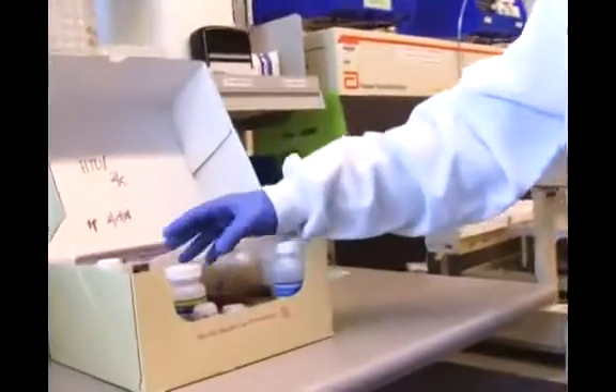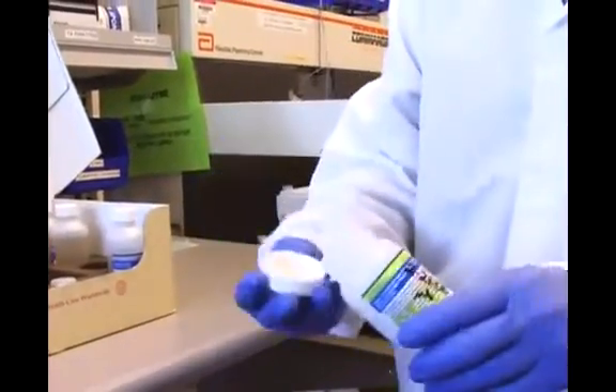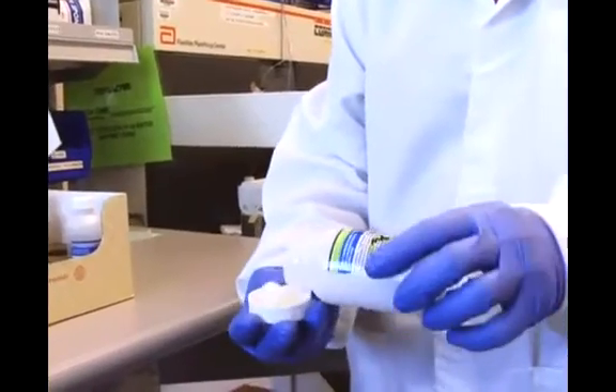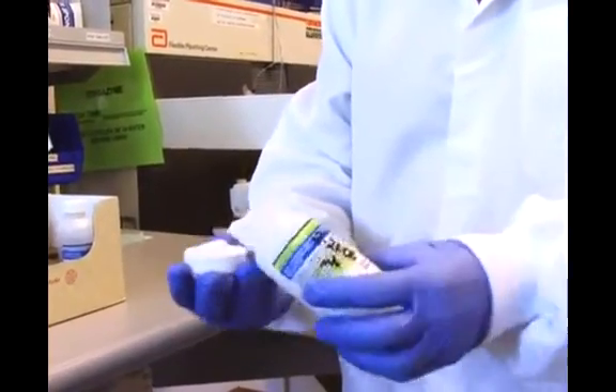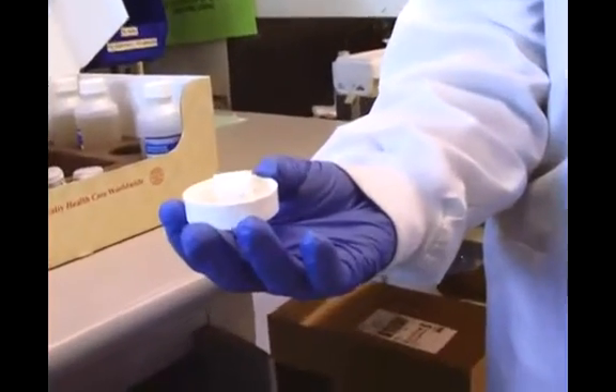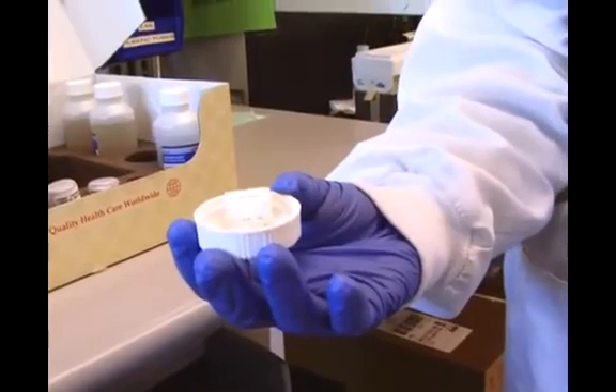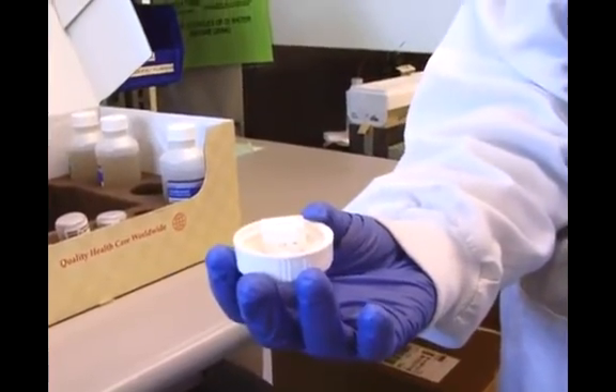The test is a bead technology test. That means that the shape we're looking for is put on a little bead, like so. This happens to be an antibody test, so coated on this bead is an antigen — the actual virus itself.